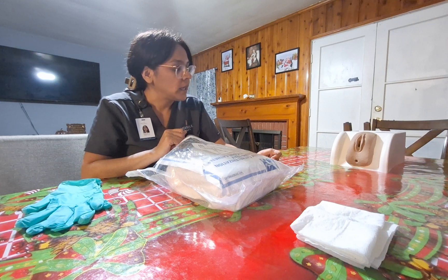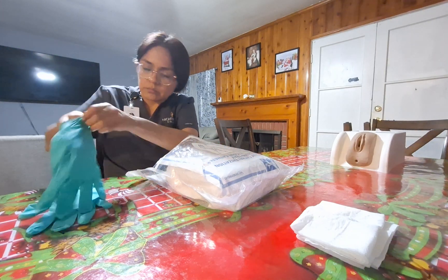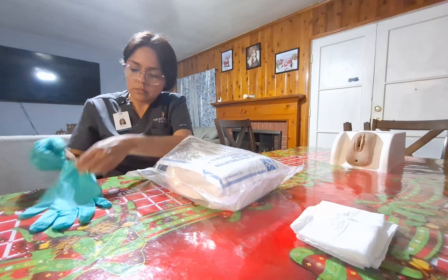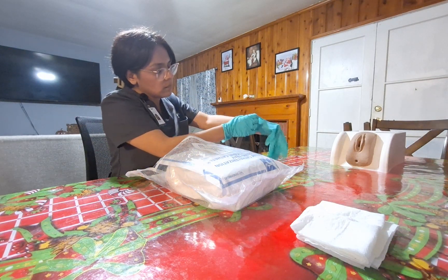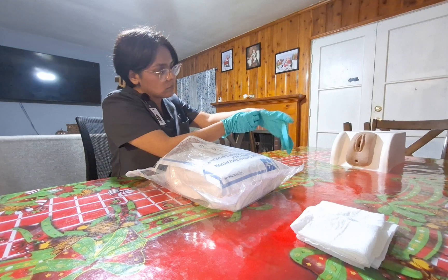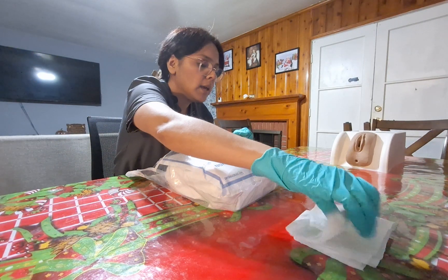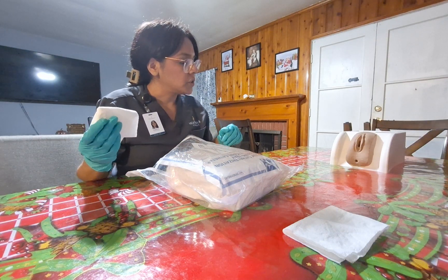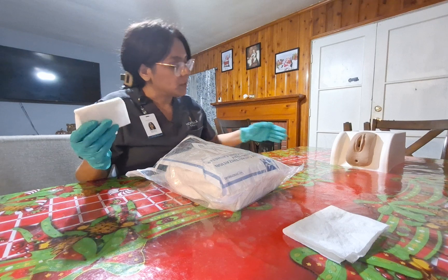So we're going to start off by cleaning the area thoroughly, and after that we'll insert the Foley catheter. I will apply clean gloves. I will grab a washcloth with no-rinse soap and water. Mrs. Garcia, can I please have you bend your knees and open your legs wide for me?